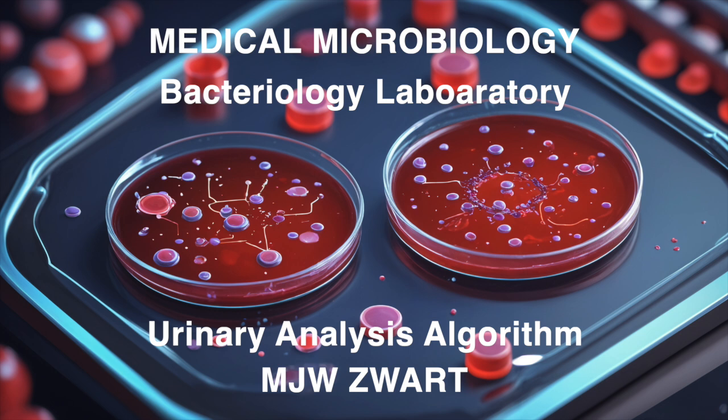There are situations where you need to go beyond those automated results and perform additional testing to get the full picture. Totally. I love that they call out those limitations. I do too. It's a reminder that we can't just blindly trust the machines. Right. We need to use our knowledge and judgment to interpret those results and know when to dig a little deeper. For example, the document specifically mentions that Vitek 2 might not always accurately detect resistance to certain antibiotics, like nitrofurantoin in Staphylococcus saprophyticus or colistin in some gram-negative bacteria.